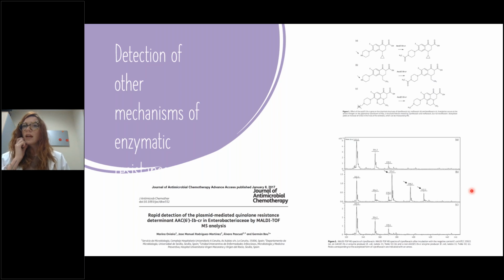What was curious here was that as it is a low activity enzyme, we could observe in the same spectrum the mass peaks of the original antibiotic and the modified antibiotic, which was really in line with this low activity, as if you only have this determinant of resistance in bacteria, usually the minimum inhibitory concentration is below the cutoff of sensitivity. So it was a very interesting approach.